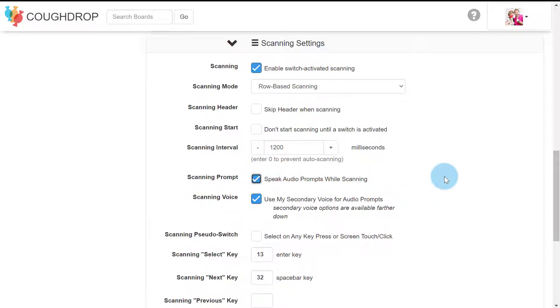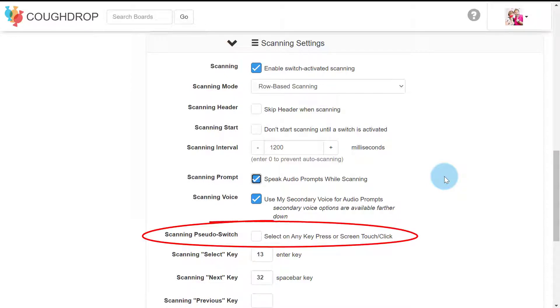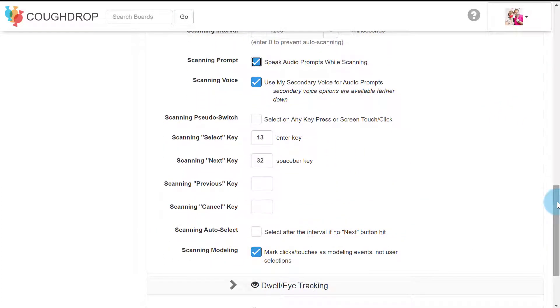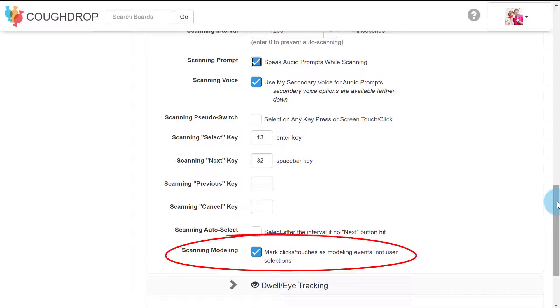You will need to set your account to recognize Bluetooth switch or keyboard hits to select speech board options. You can choose to have the program recognize any keyboard press or screen tap as selecting a highlighted button, even if the screen tap is not on the button itself. You can also assign the system to recognize screen presses as modeled language if your communicator will be using the switch exclusively to make selections and you want screen presses noted as modeled words.